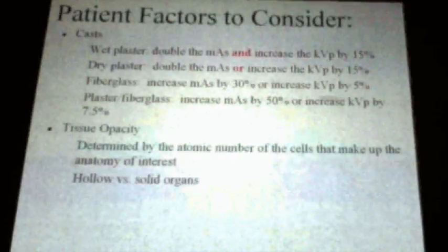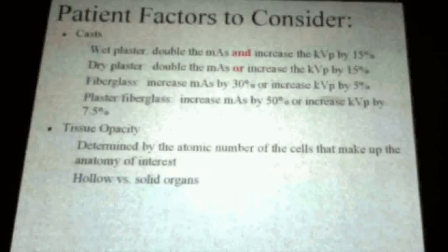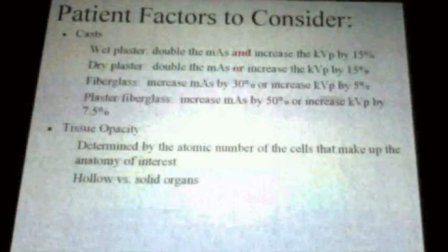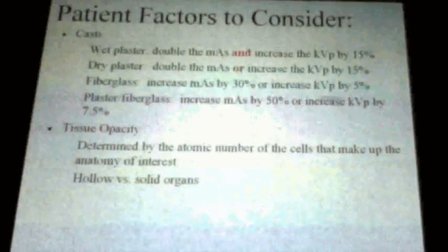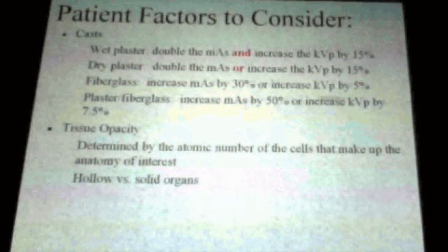Okay. What if you were to process a film without exposing it to anything? What would it look like? Without exposing it to anything, it would be clear. So unexposed areas are clear. Exposed areas are black.